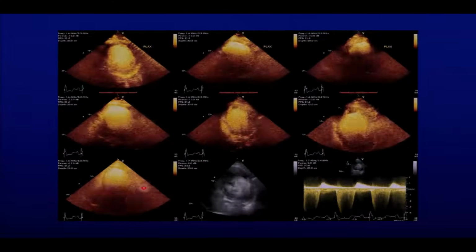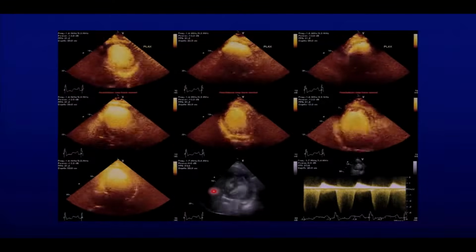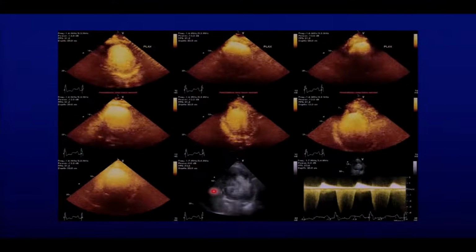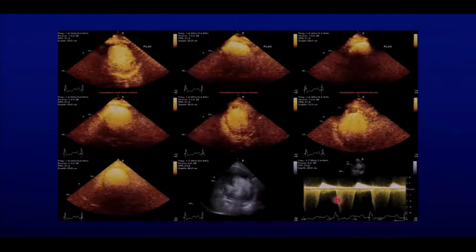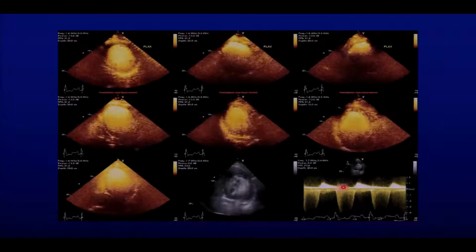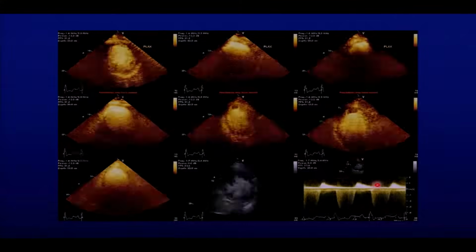They realized they gave too much, and they would not want to wait another minute or 2. Increase your MI, so you go from one extreme to another. Then I need more contrast. Right? So the best in those situations is just wait a little bit. At least they got the Doppler afterwards, indeed, after the MI was increased.